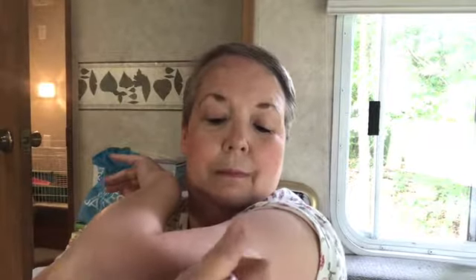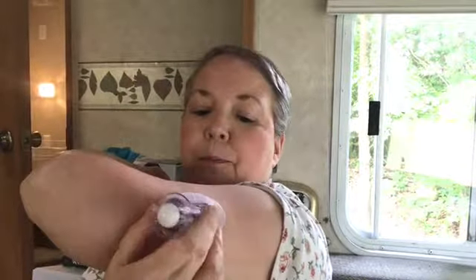I got it. Okay. Got it all the way. You see how it went click, click? Then I push this part, it has to go back up. Okay, it doesn't want to come back up. Okay, now it's all the way up. I don't see any blood there. And then this, I have to squeeze. See, there's 2 spots. One here and one here that I need to squeeze to get it off.